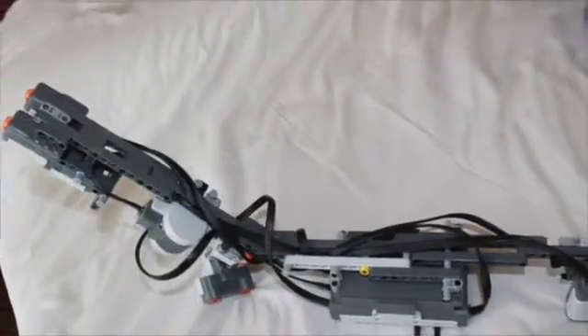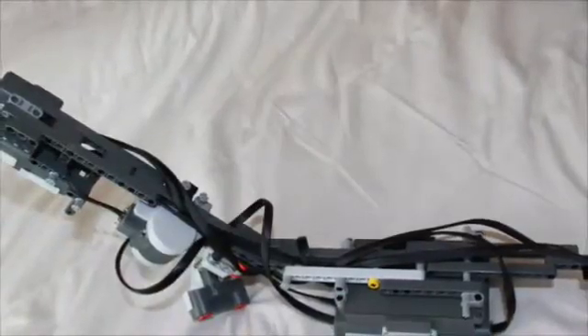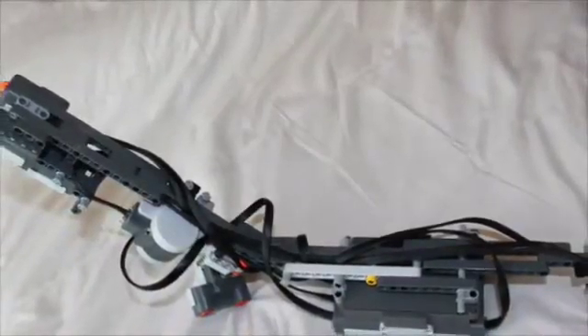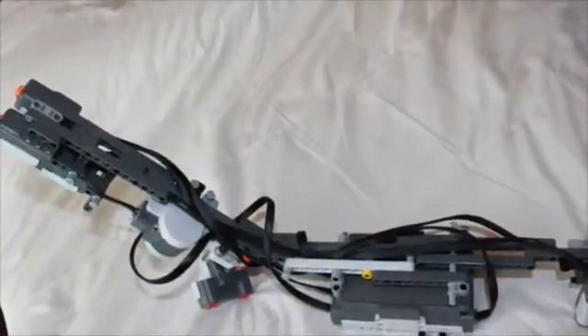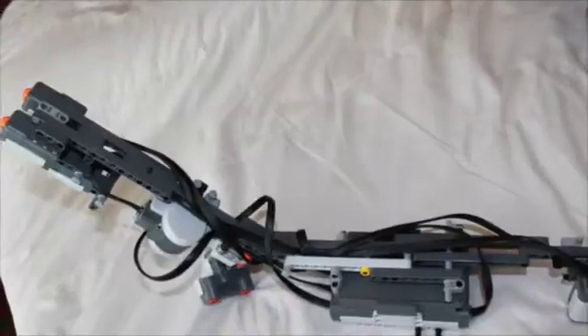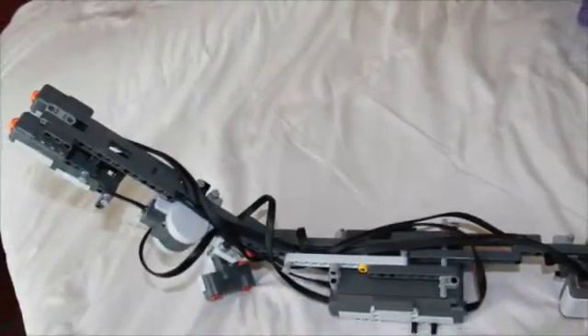This is the entire project, all wired up and ready to be used. The first program I plan to run is the color sensor program, which will help the blind person actually hear or listen to the color that is in front of them. I've used post-it notes for simplicity, and the blind person just has to place the color in front of the color sensor, as shown here.